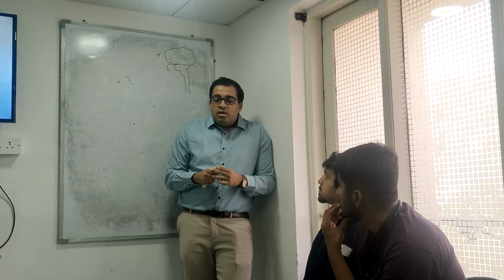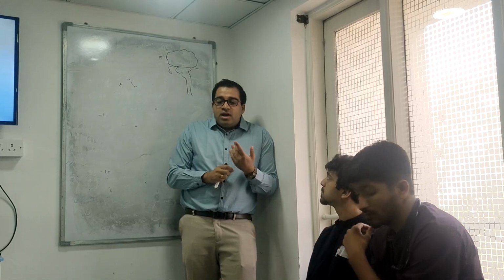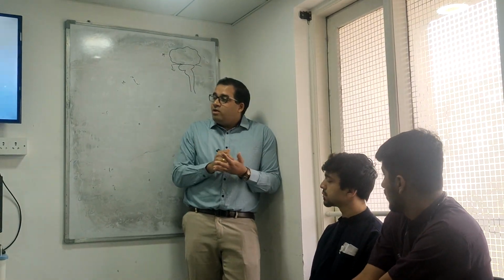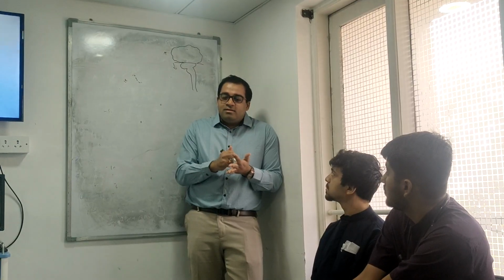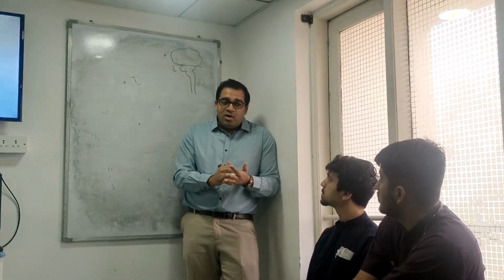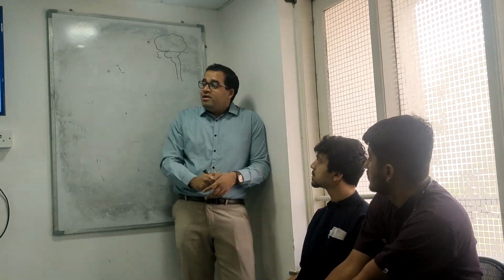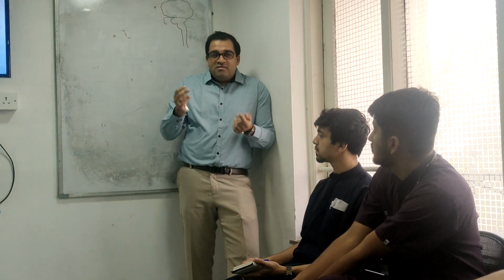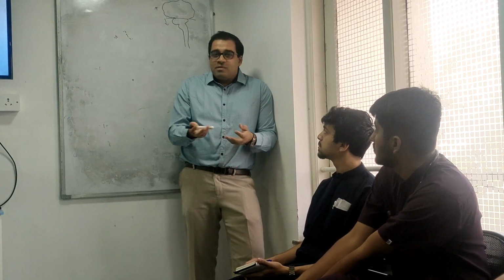Okay. Now we are evolving to getting diagnosis earlier and earlier. अभी GPC flag हुआ है, GNB flag हुआ है, day 2 पे you'll get an ID, day 3 पे you'll get sensitivity. Imagine in a septic shock patient, you're waiting 3 days to get a diagnosis of the blood culture. And today everything is available at your fingertips in 10 minutes, 15 minutes. So is there anything we can do to optimize this process to get this earlier?